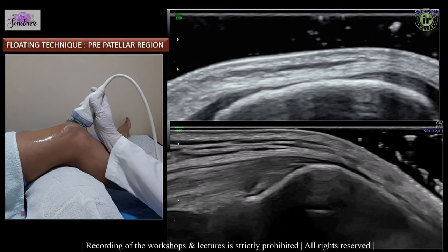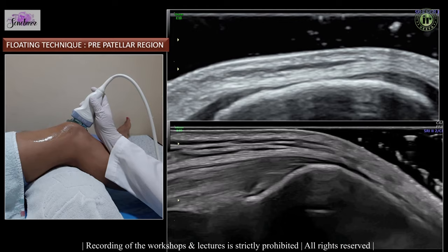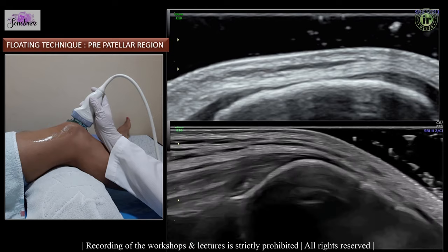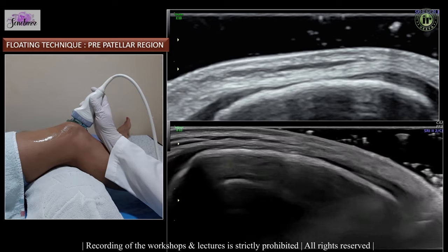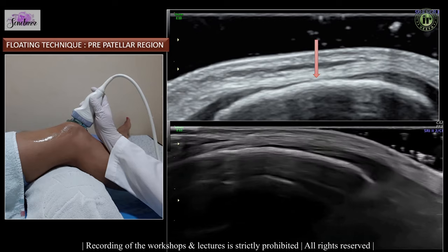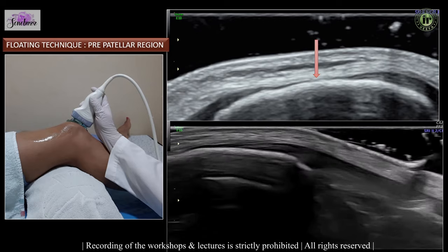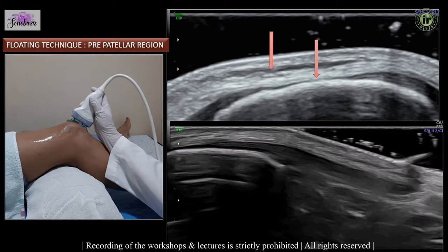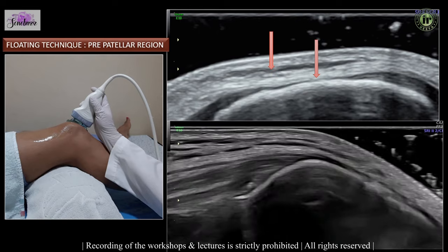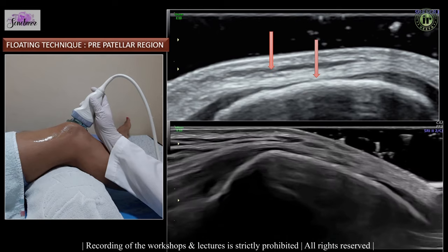In the prepatellar region, we use a floating technique — we put a lot of gel over the patella and place the probe very lightly over it to avoid any compression, so that we can visualize the superficial fibers from the rectus femoris crossing over the patella and joining the patellar tendon below. Also note this area for the prepatellar bursa, which is usually not seen on ultrasound normally if it is not inflamed and distended.